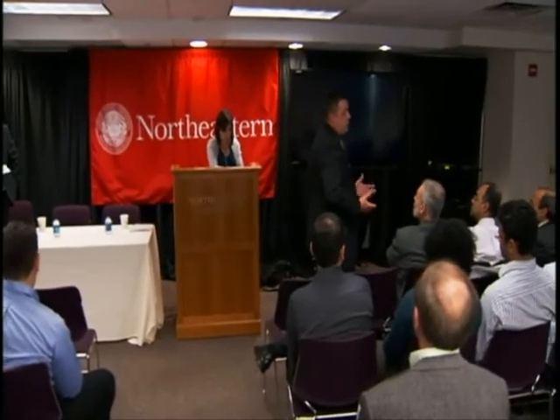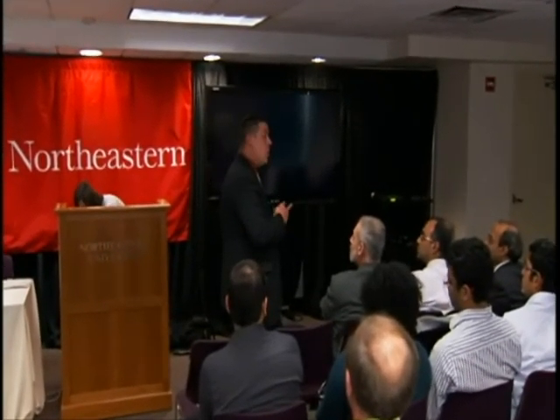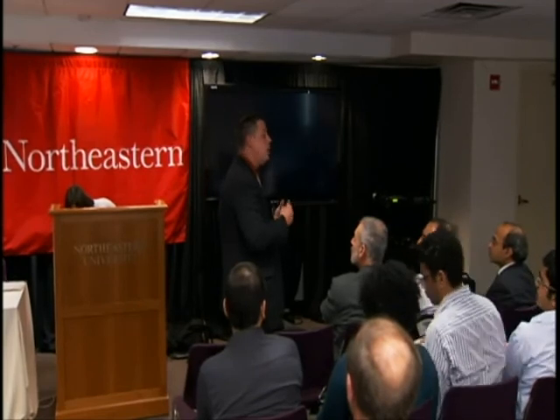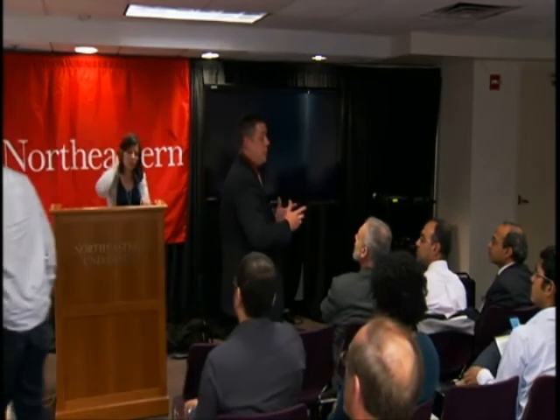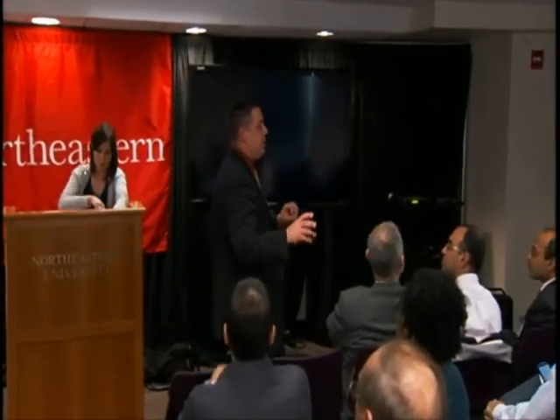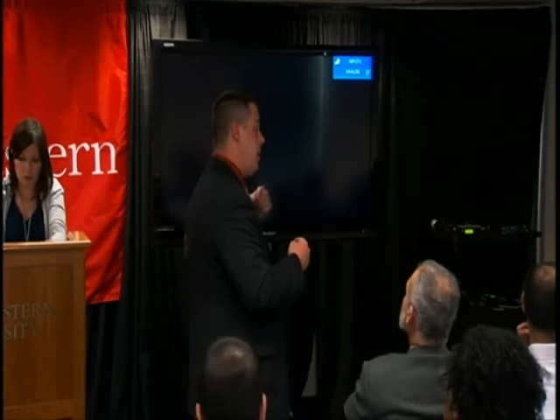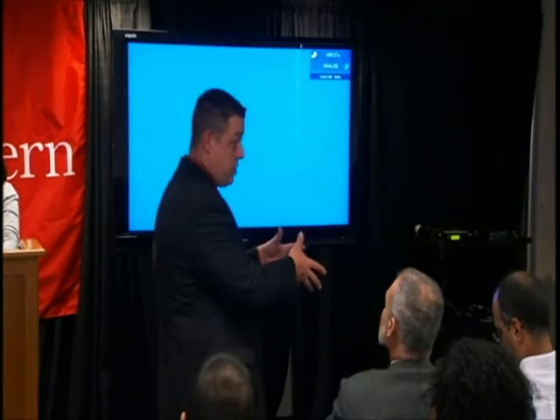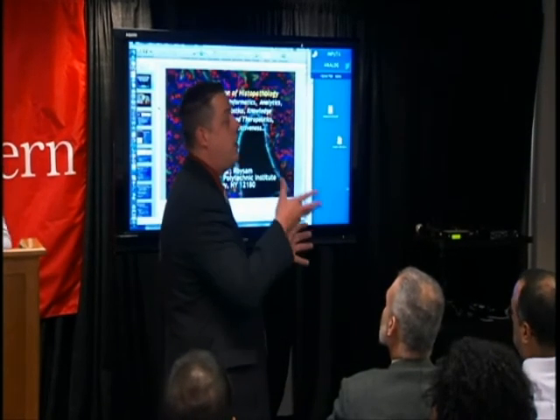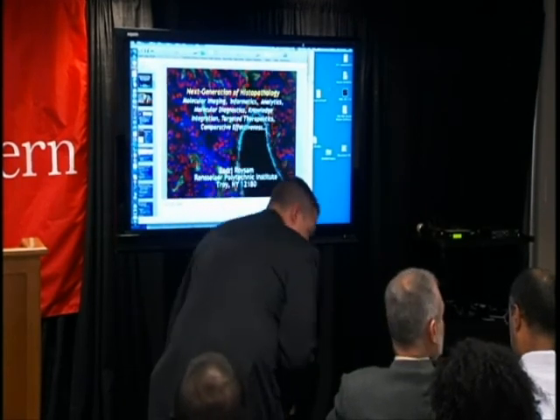We've been lucky enough to work with dermatopathologists who are licensed in multiple states. The system knows where they're licensed and sends only those images which they're licensed and credentialed to read. It's a rules-based system where we can set up rules and only send images to the appropriate reader. It is a 24-hour online system; it's the rules that are being enforced. Every time an image set is captured, we know where it's coming from and where that patient is based, internal to the system. The system can then route it to an appropriate licensed dermatopathologist. Great. Make sense? Yes, thank you. Sure. Any other questions?